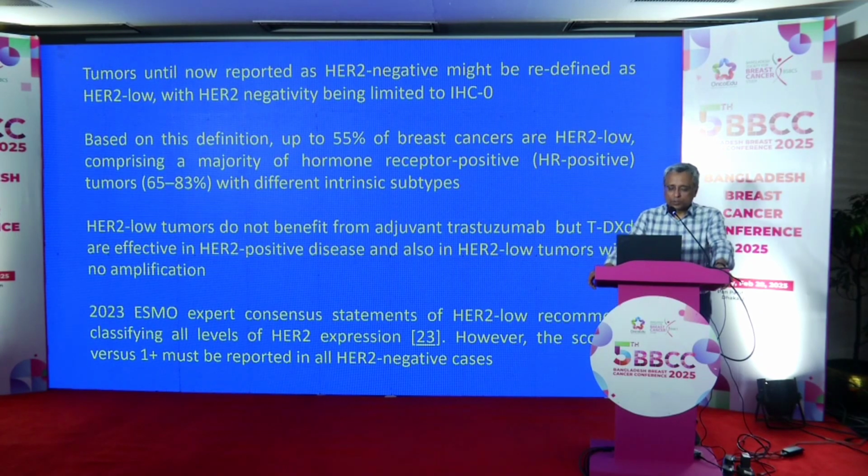So a little bit about HER2. For many years, HER2 was, as you all know, positive, equivocal, and negative. But now, recently, there's a new category of HER2 low, which has also led to HER2 ultra low. So it has made HER2 immunohistochemistry very complicated, especially the interpretation part. So you need to be careful when you interpret HER2. You need to be as specific as practically possible, even if it's a low expression, about how much is positive.